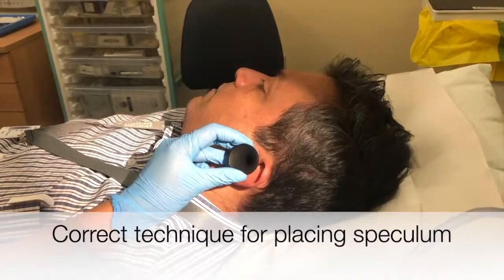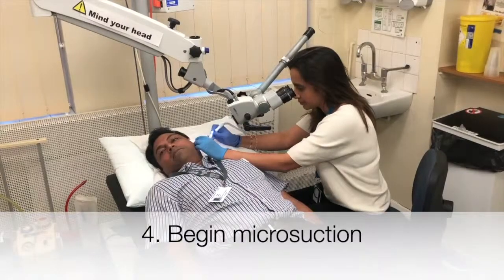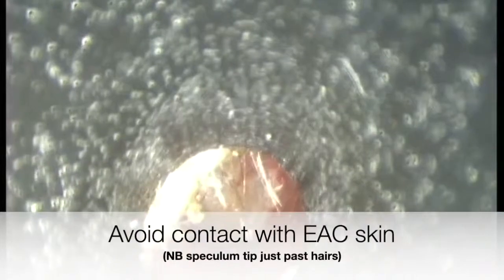This is a demonstration of the correct technique for placing a speculum. Begin microsuction, avoiding contact with the external ear canal skin at all times.